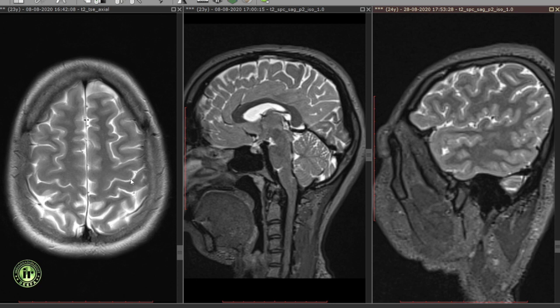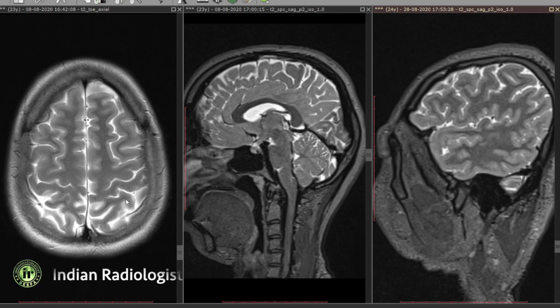The central sulcus, also known as the rolandic fissure, forms the boundary between the frontal and the parietal lobes, separating the motor cortex in the precentral gyrus from the sensory strip in the postcentral gyrus. Its identification is important when surgery is planned in the vicinity of the motor cortex.